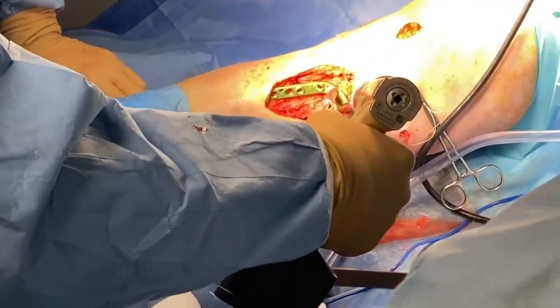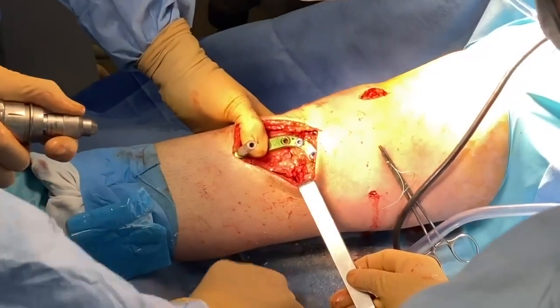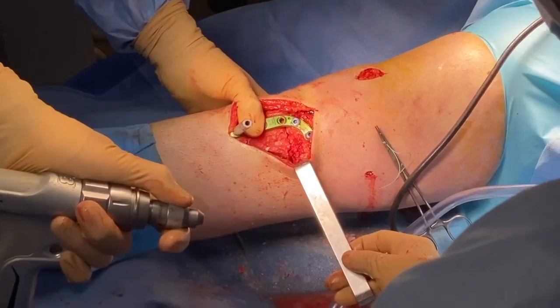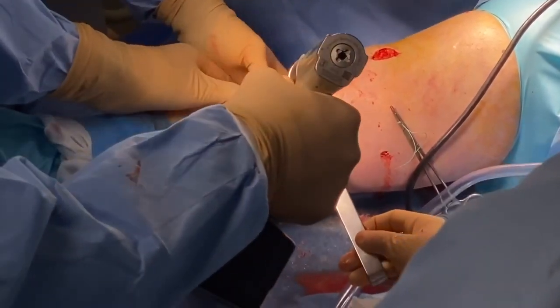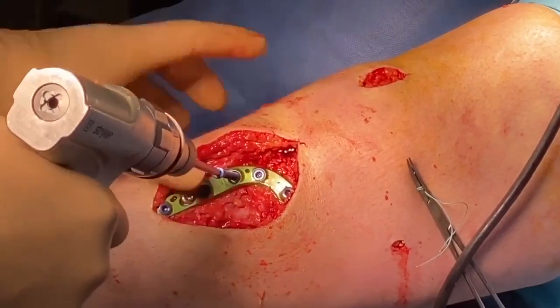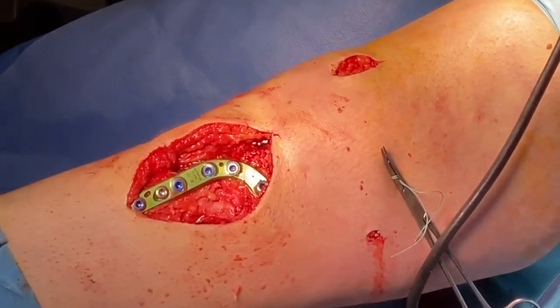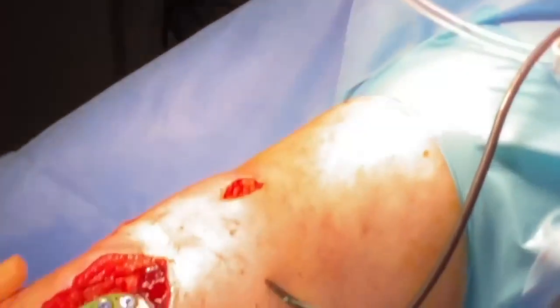The 3 screws are positioned, as you can see here, and we reduce the osteotomy site in full extension. And this first screw, which is positioned distally, is a cortical screw to create the compression anteriorly and medially and reduce both planes at the same time. We then secure the osteotomy with more locking screws surrounding the cortical screw, which is the gray one in the distal aspect of the plate.